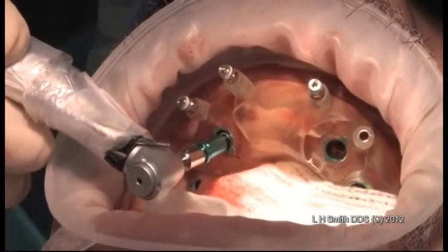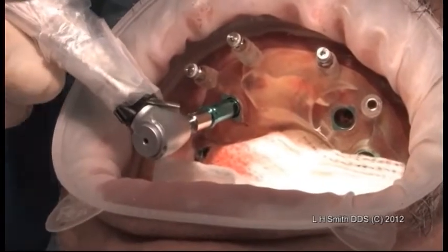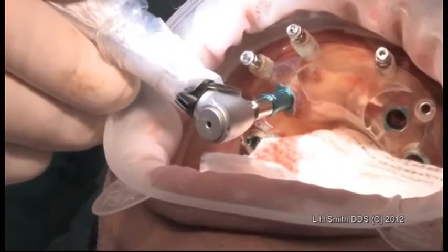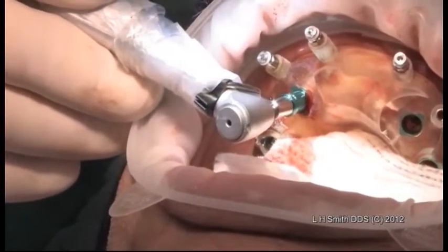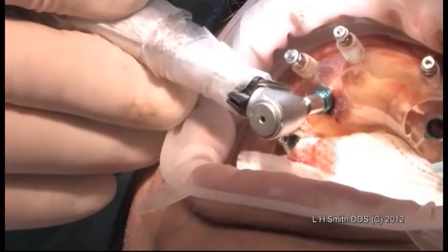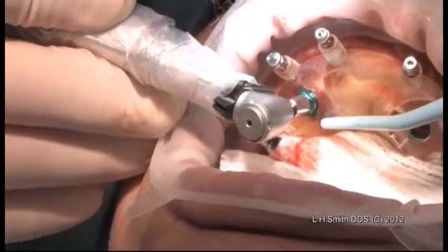Now I'm going to go back. I've gone to 35, so now we're going to reinsert. At this point, if it doesn't seat down within two millimeters, then we're going to a larger osteotomy drill. So far, so good. It's beautiful.